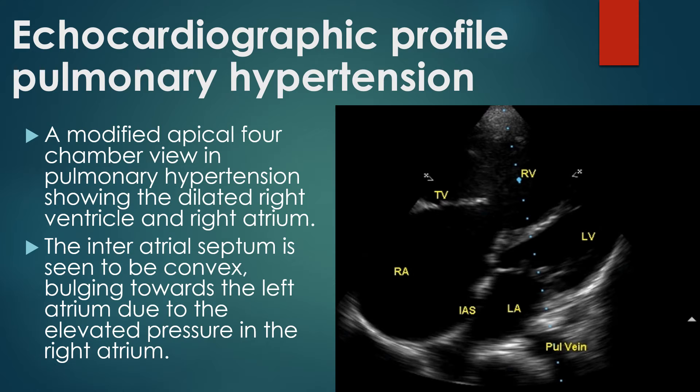A modified apical 4-chamber view in pulmonary hypertension shows the dilated right ventricle and right atrium. The inter-atrial septum is seen to be convex, bulging towards the left atrium due to elevated right atrial pressures. An echo dropout is seen in the region of the fossa ovalis due to the thinness of the stretched septum in that region.